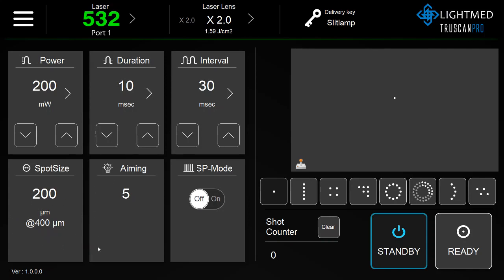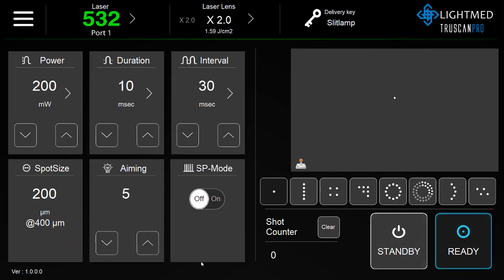In order to adjust the aiming beam intensity, the unit must be on ready mode. Use the up and down arrows to turn up the intensity of the aiming beam.